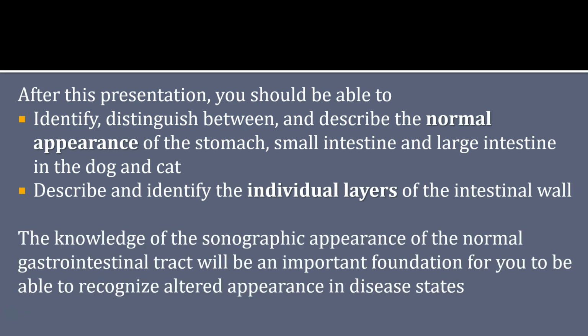This presentation is going to give us the important foundation of normal that we need as we move into the next presentation and recognize the altered appearance in various disease states.